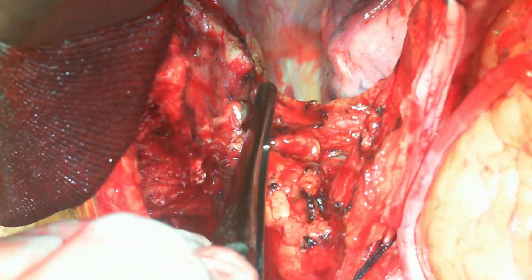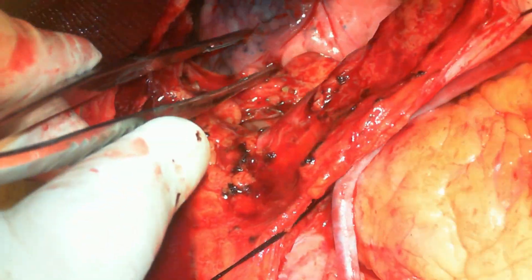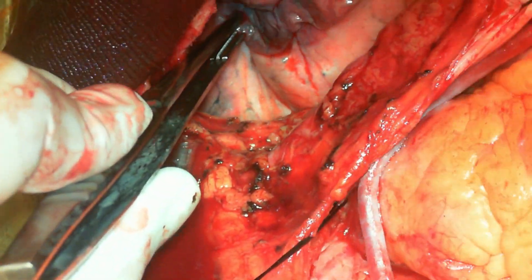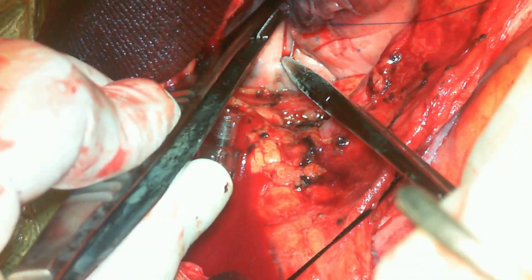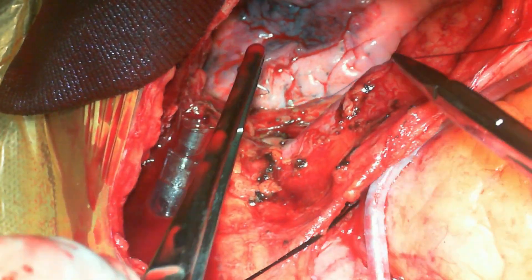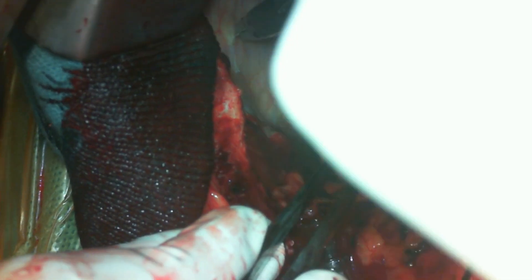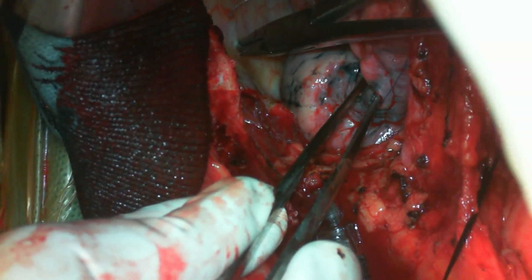Once I have dissected that extra inch of mammary, I am taking a bite in the upper lobe of the left lung with a big needle for prolene and fixing it to the lateral chest wall. It's a double-arm needle, and I'm taking a deep bite to fix it to the lateral chest wall.